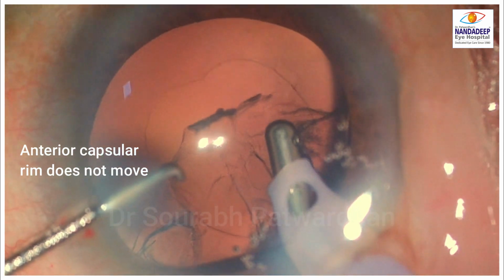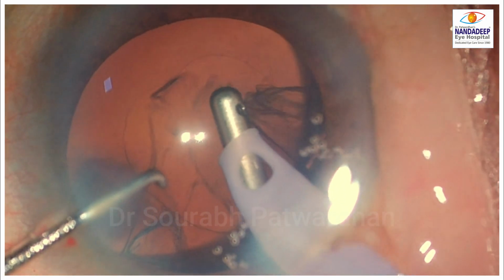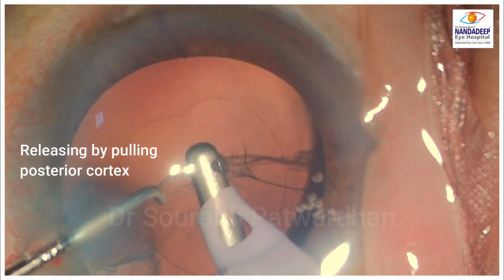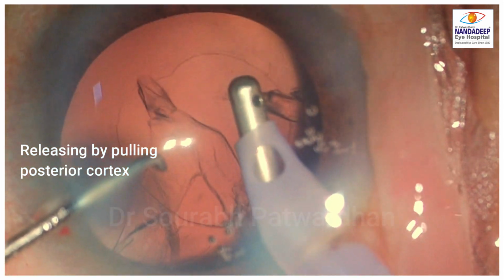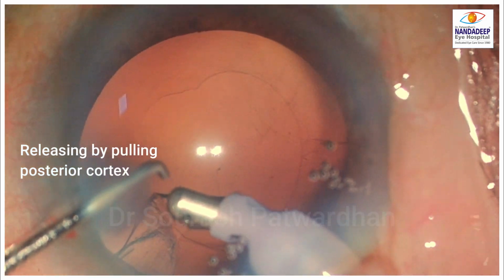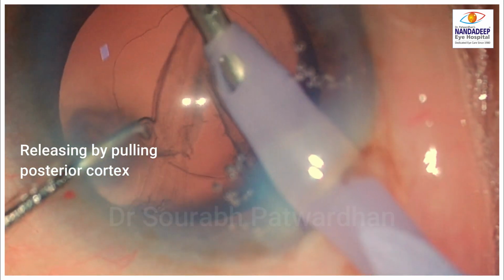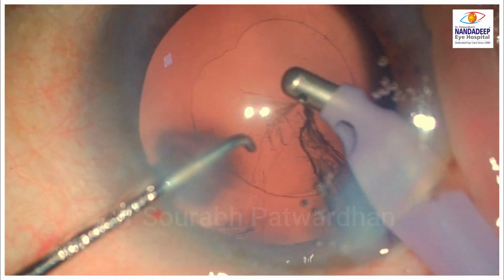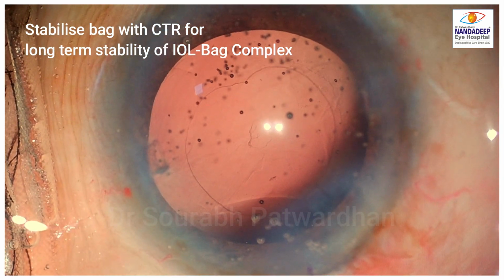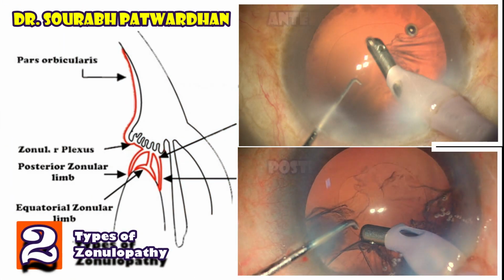Again, just demonstrating that the anterior capsular rim does not move, so the zonular weakness is restricted to posterior zonules. You can also release the cortex carefully by holding the posterior part of the cortex and release it slowly from the posterior capsule. And it is recommended to put a capsular tension ring for long-term stability of the IOL bag complex.